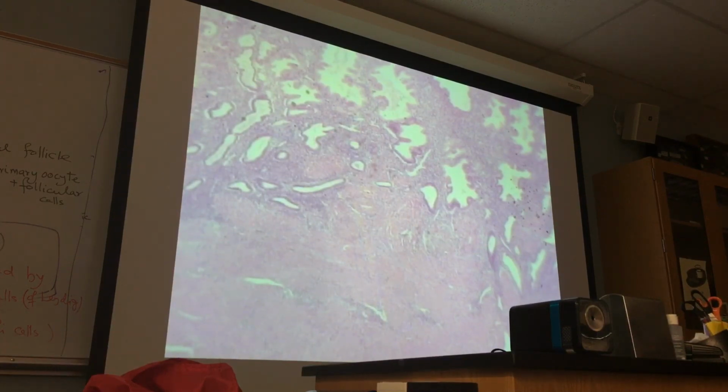That will do. And this will be stratum basalis or basal layer, and this will be myometrium. Okay, so you have reference points like endometrium and myometrium. If I ask you identify the organ, uterus. Okay, that's it.